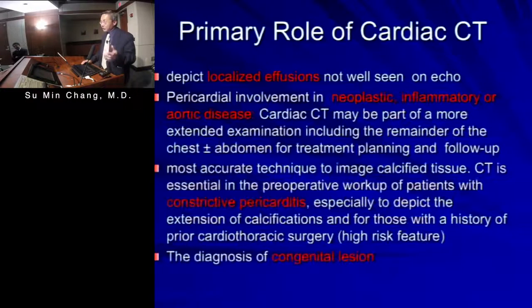I'm going to start with actually my conclusion slides. I changed it right there. The primary role of CT is to try to find the localized effusion that you plan to do surgical intervention on, that you cannot assess well in echo. I'll show you some cases.